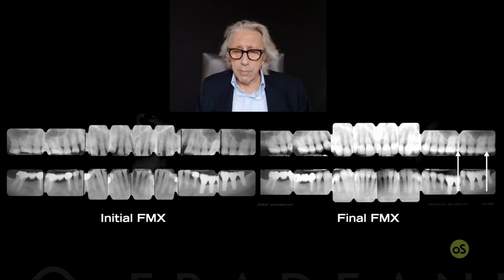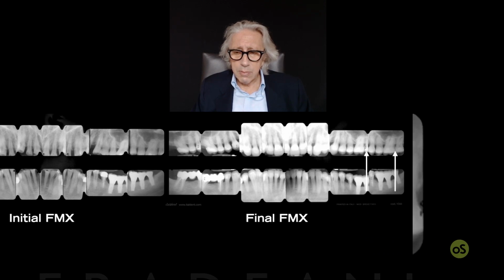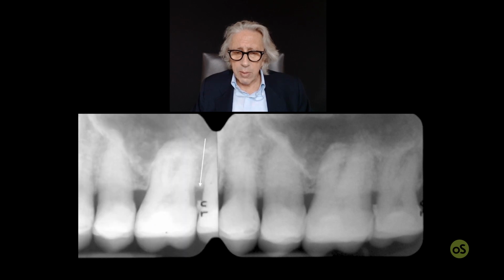But look at this. What happened there? Let me show you. A piece of cement over there. Very delicate. Now I want to tell you the story.